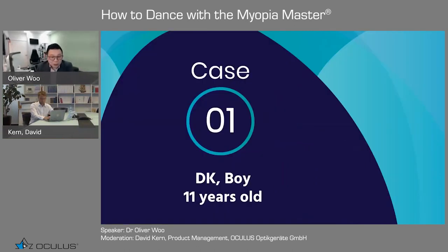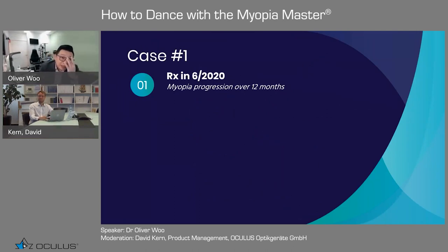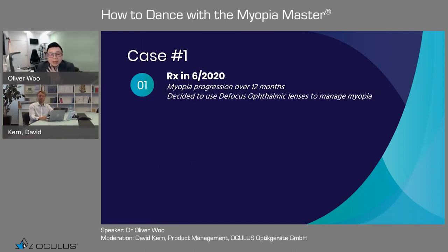There's a little case study I'd love to share with you. The number one case is a boy, 11 years of age. He came to my practice in June 2020 because the mom said the kid was having really quick progression over the last 12 months. They used to use single vision glasses, and they decided to use defocus lenses to manage myopia because the parent doesn't want to do any contact lens for the kids. That's why we chose the defocus lenses.